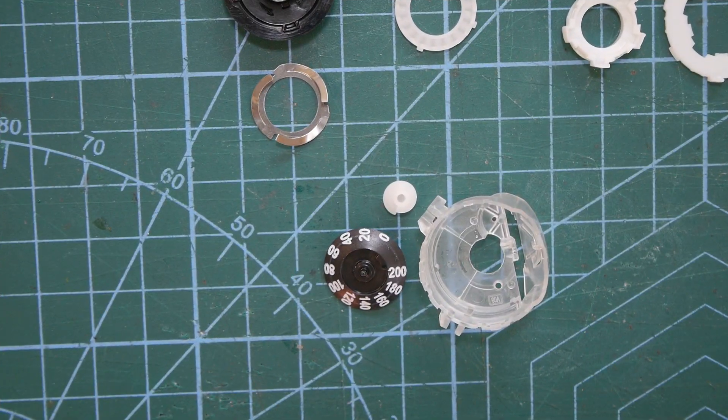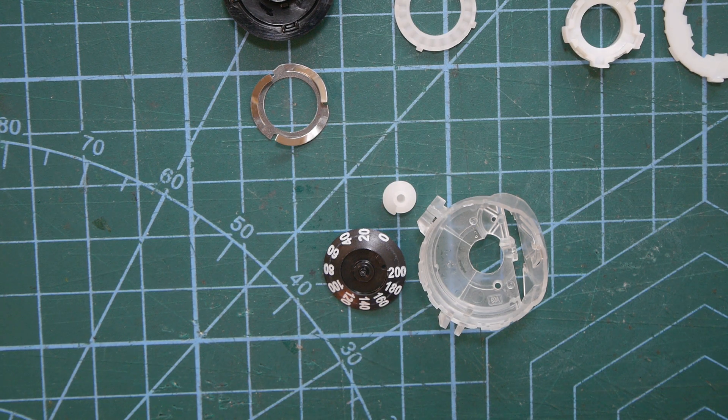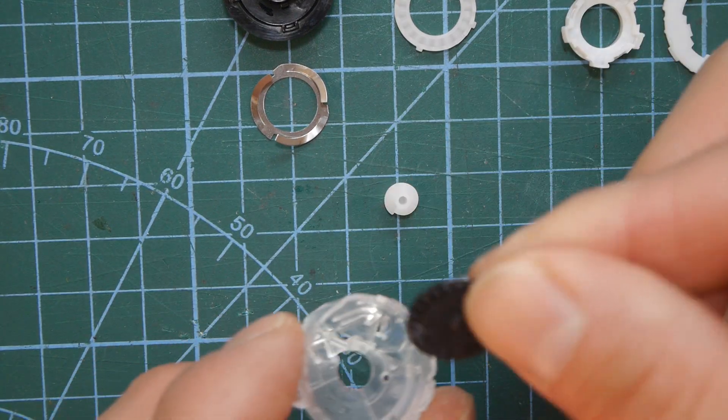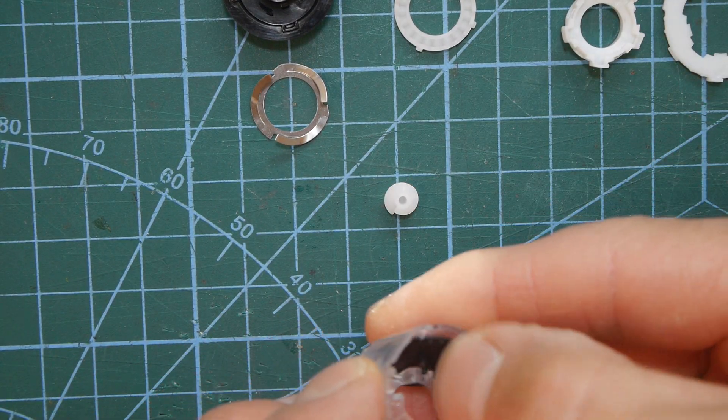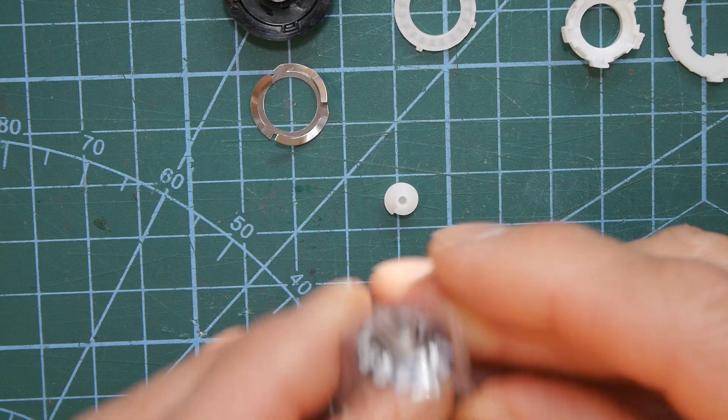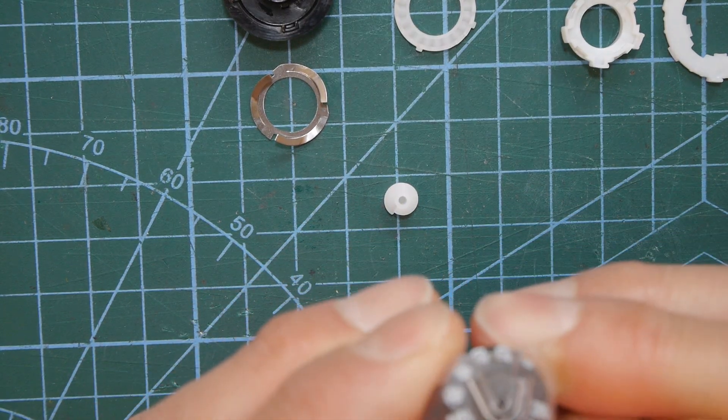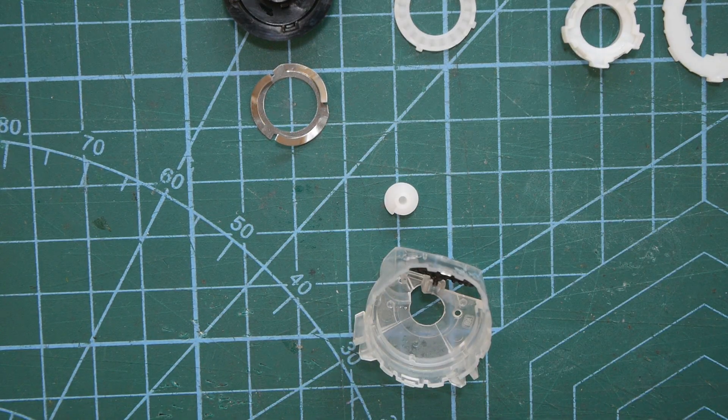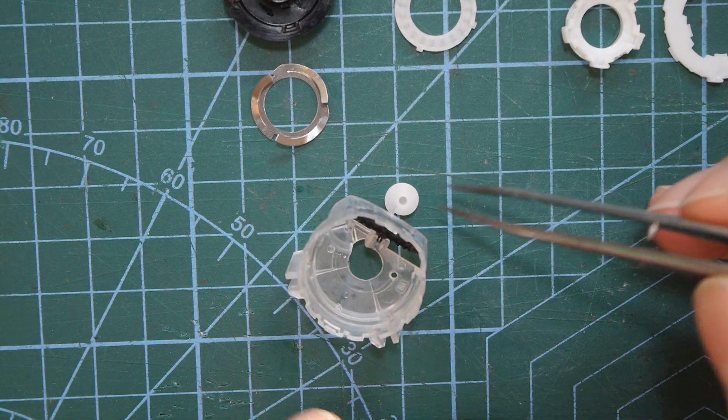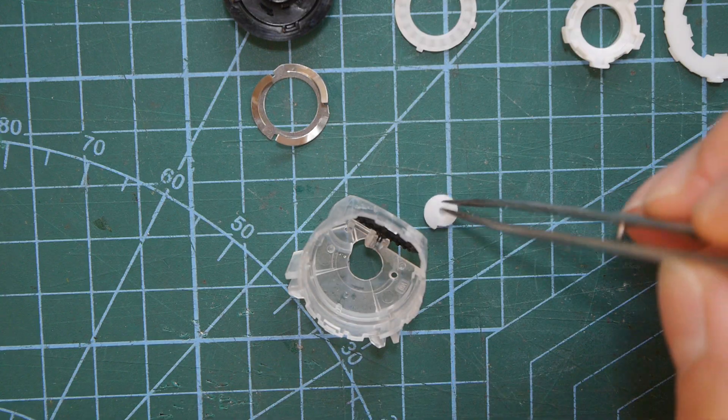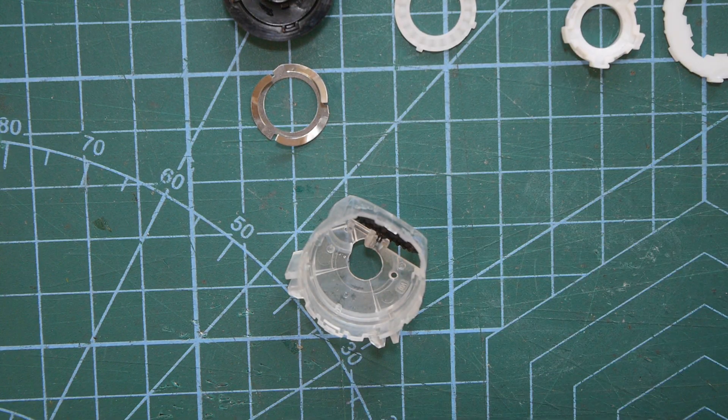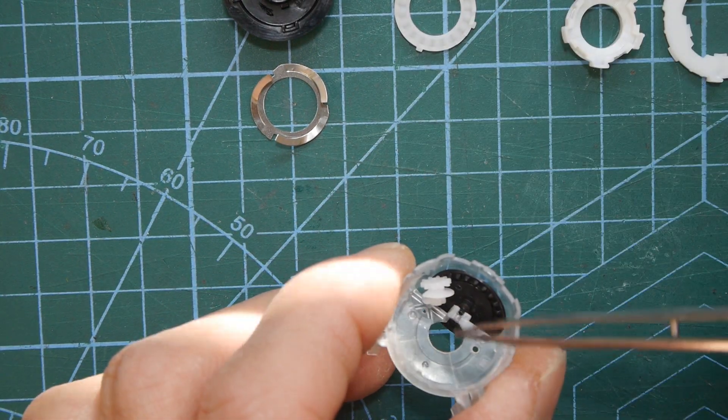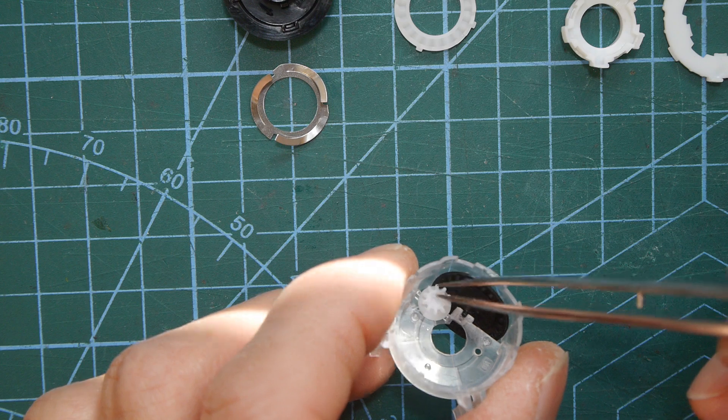So let's do something really rather strange and it's the opposite of what you do as a kid. To explain how this works it's actually easier to do it by putting the whole thing back together. So there's the counter wheel and I've got to get it to click into place. Then I've got to put the little worm drive in place and remember that has its own shaft.